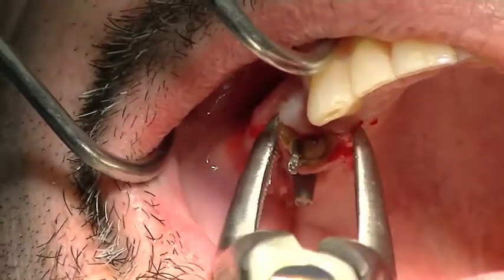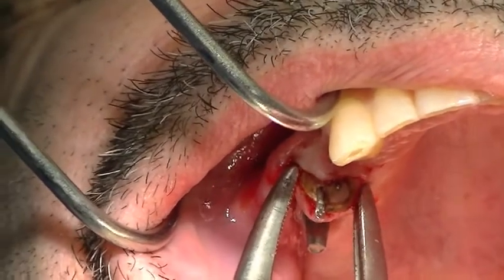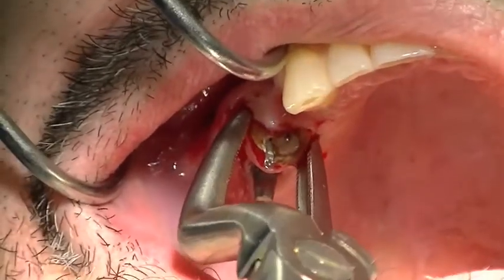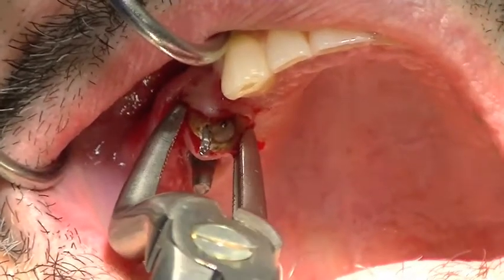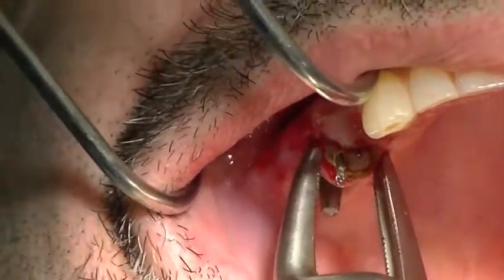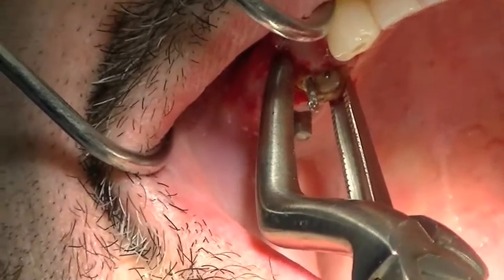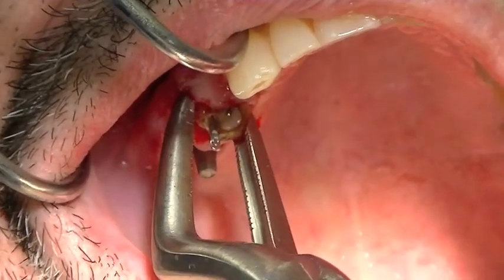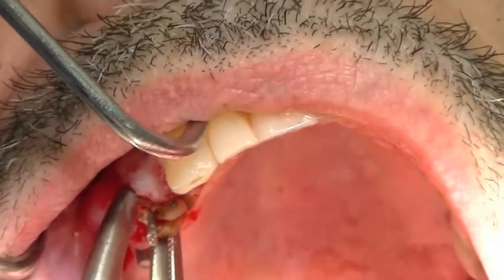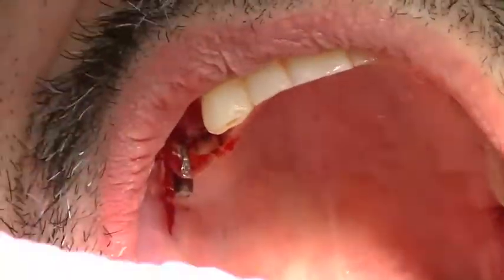The instrument is not intended to remove the tooth in total, so we'll take a tooth delivery instrument to try to grab onto this fractured tooth and remove it. It can be a difficult process trying to grab onto the fractured root surfaces. The periodontal ligament has been disengaged and the tooth is basically mobile, and I'm just trying to use an instrument to elevate the tooth out of the socket, trying to create a purchase point.